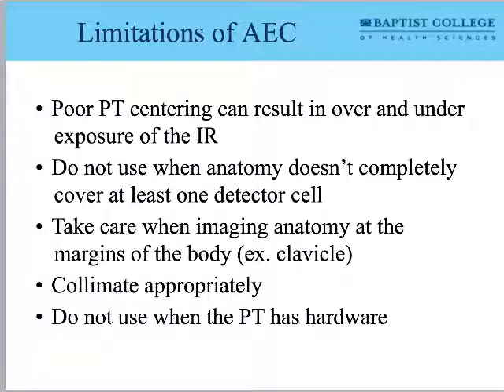All right. And anytime the patient has hardware, or they've drank barium, or they've swallowed a bunch of Barbie dolls, or they've placed something in their rectum, you do not need to use an AEC. So if there's any suspicion of metal, surgical hardware, anything in that area of interest, what's going to happen?